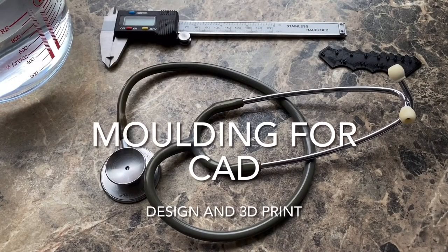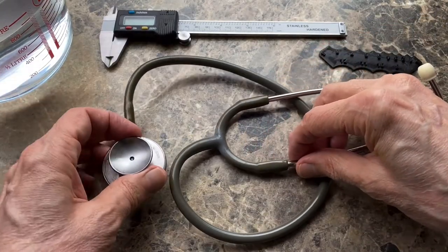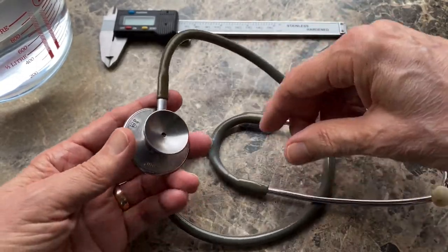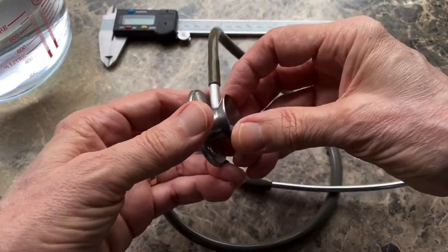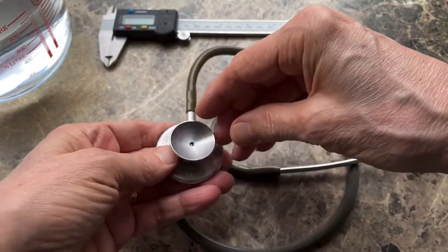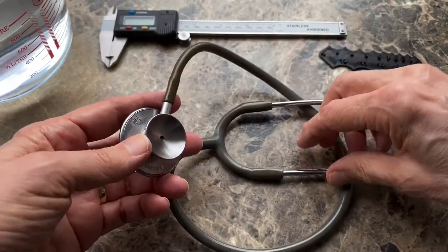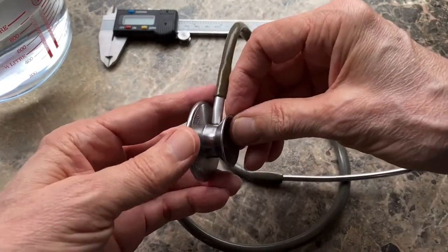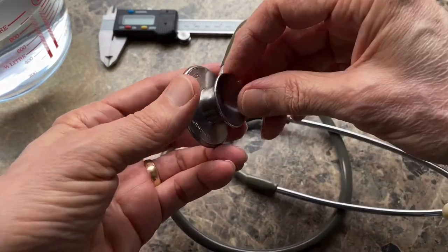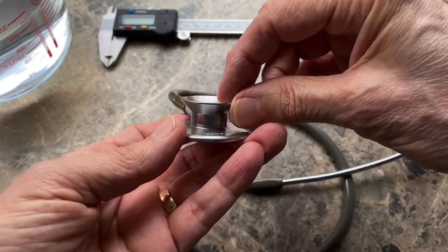I'm going to try and make a short video about how to make a small rubber ring for this stethoscope. It's an anti-chill ring so that you don't put the cold metal against somebody's skin when you're listening to their chest. I've had this stethoscope for over 40 years and I probably lost the ring 30 years ago. I expect it perished but it shouldn't be too difficult to design something 3D printable in TPU.